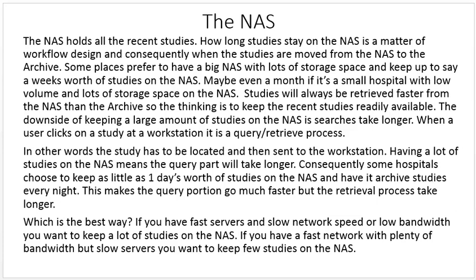When the user clicks on a study at a workstation, it's a query retrieve process, meaning he has to go look for it and pull it back. Query and retrieve. Go look for it, pull it back. In other words, the study has to be located and then sent to the workstation. Having a lot of studies on the NAS means the query part of that equation will take longer. Consequently, some hospitals choose to keep as little as 1 day's worth of studies on the NAS and have it archive studies every night. This makes the query portion go much faster, but the retrieval process takes longer.